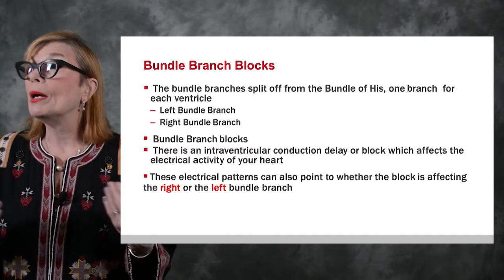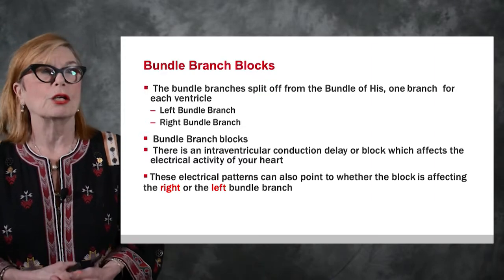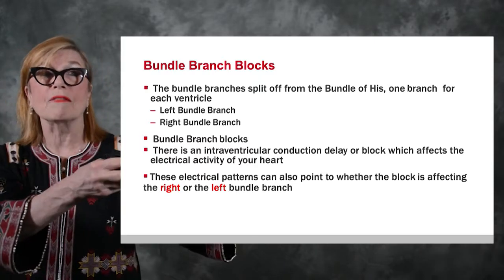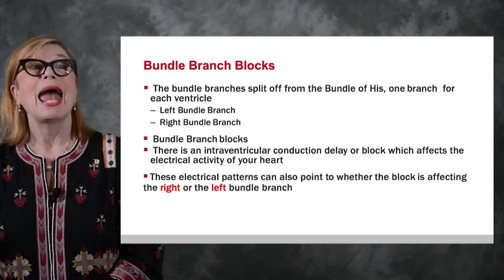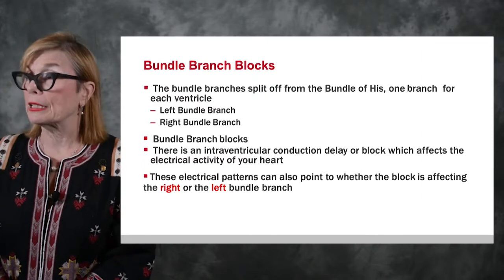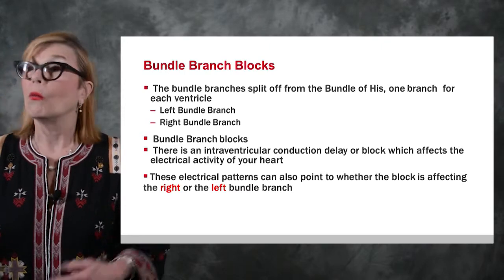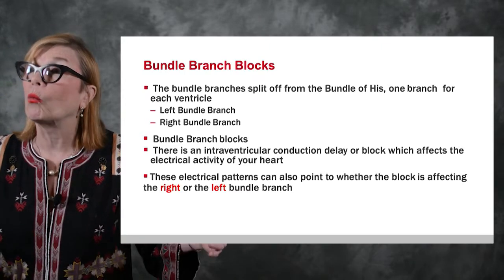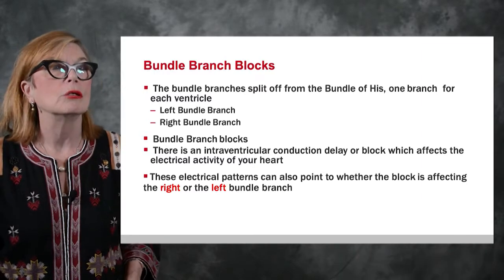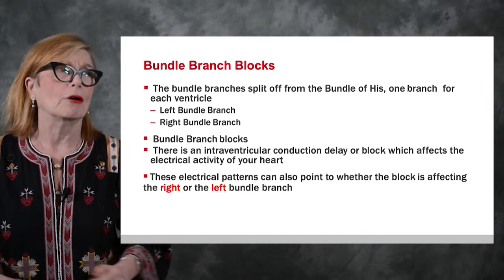Now, what we look at when we look at the depolarization of our ventricle, which we commonly call the QRS, is actually direction, meaning it should go towards the left because the left ventricle is the bigger ventricle, and time. Now that's what's really important here, because when you have a ventricular conduction delay, it's going to take much more time for the ventricle to depolarize. So when there's a delay, that means the width of your QRS is, yes, greater than 0.12. Remember, we focused a lot on the width of the QRS. With bundle branch block, you'll be wider than 0.12.